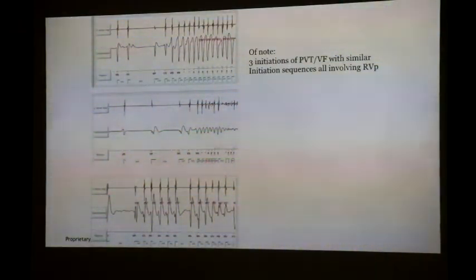Just the pacing, not the pacemaker. Just turn pacing totally off. This is what you should consider. I'm not saying you should do it in every patient, but you should consider turning it off fully. So your primary prevention patient, you put a device into, right?